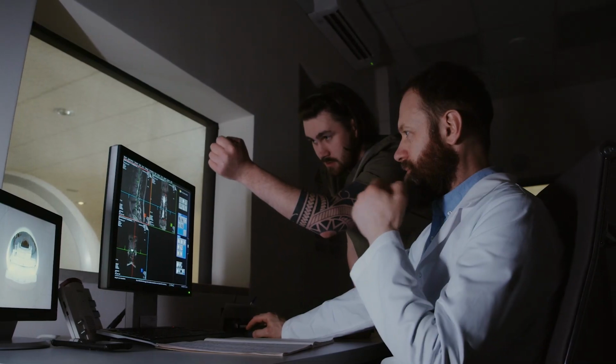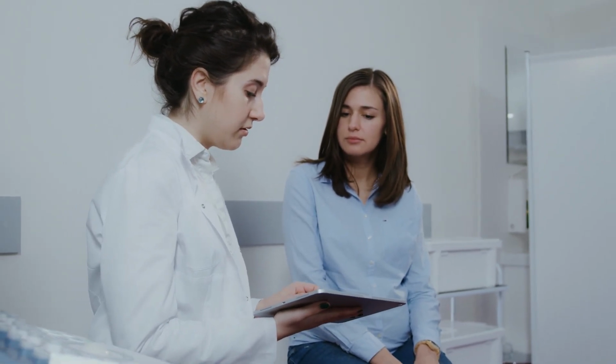Yeah, exactly. And if you observe at your hospital, the doctor probably opens his computer. You all would have wondered, what are doctors doing with computers, right? This is one of the things that they use. Everything is being digitized. Doctors have been using applications to key in the patient observations. That's why the moment you give your patient ID, everything, history, who saw you, comes at one shot. Adding to it, there is always something that he shows you on the computer, turns the monitor and says, this is where your fracture is. That's because of the DICOM. It's a digitized format of your X-rays and scans.